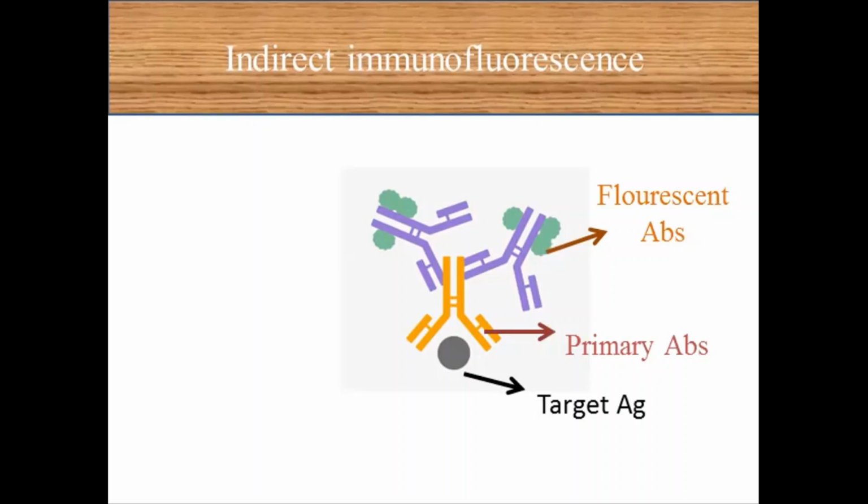So, we call it indirect immunofluorescence.